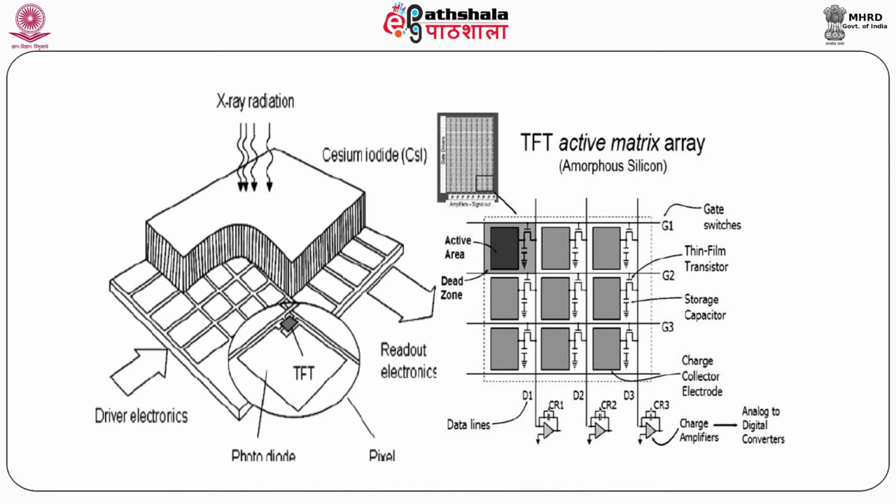Digital detectors have a wide dynamic range. Moreover, the implementation of fully digital PACS with DR is possible, in which images are stored digitally. They can be transmitted within the department or anywhere. Patient dose reduction is possible.